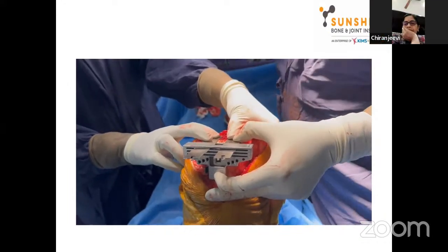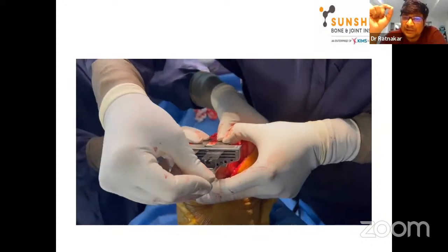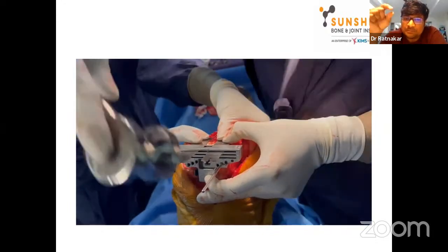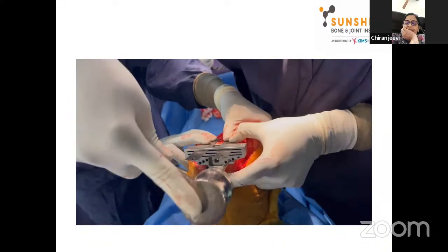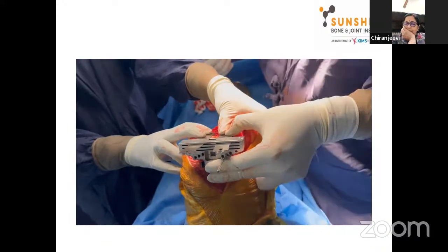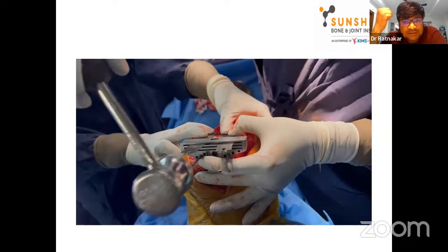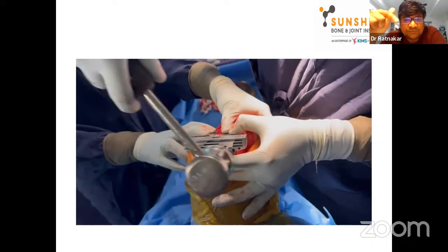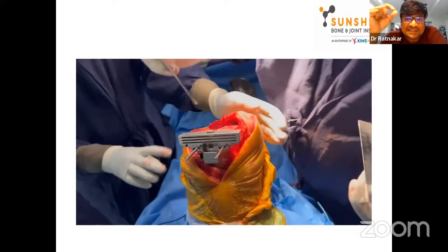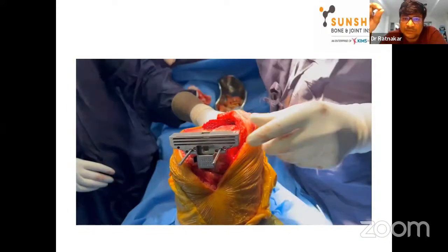And then place your pins at the initial cutting site which you used initially, that is 0 mm. So I'm placing both the pins, medial and lateral. The blades are completely flushed to the distal cutting area. Now you can take off your blades. The jig is in place. So it is for the previous cut, the preliminary cut, whatever distal femur cut you have taken.